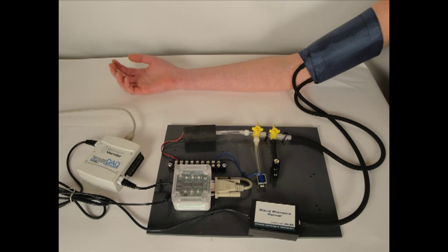The Vernier LabQuest, or SensorDAQ, drives a Vernier digital control unit and reads the blood pressure with a Vernier blood pressure sensor. The small air pump, bleed valve, and solenoid-controlled relief valve are scavenged from an inexpensive home blood pressure system. The T-valves are used to diagnose the system, but are not required for the system's operation.